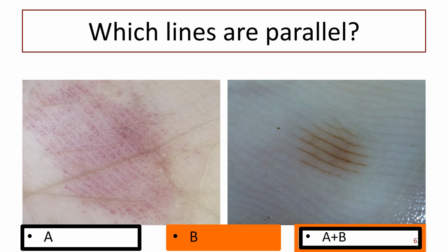Yes, that's right. Let's go away from the knee; it's perhaps easier to see. You may not all be able to see it, but you should see a little row of white dots, and the white dots are on the ridges. If you go closer here, the white dots are just discernible. That tells us that the pigment is in the furrow, and that's good news, because furrow is fine. Furrow, fine. Ridge is rotten. Furrow is fine.